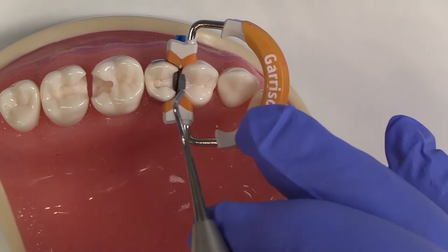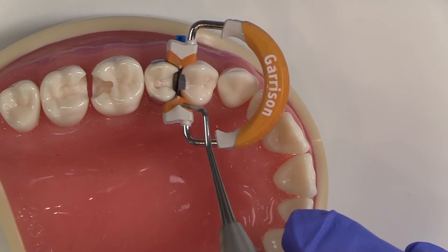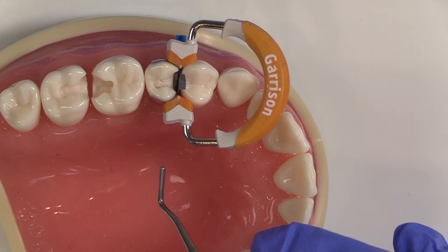Remember, it's not the wedge alone that gives me the perfect contact — it's the combination of the thin matrix band and the wedging power of the ring. This ring creates just enough wedging on its own for an ideal contact. If I wedge too tightly with the wedge, I end up with a really tight contact that's difficult to floss, and I've had patients complain about that.